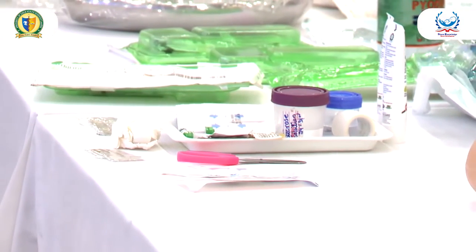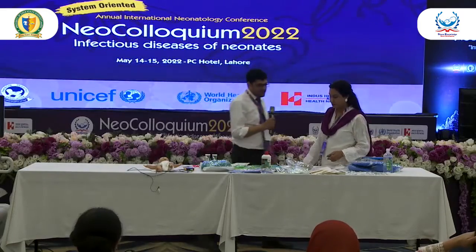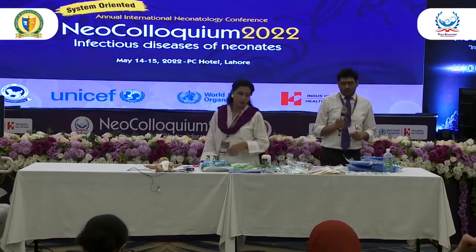Assalamualaikum. We are about to begin the demonstration for PICC line insertion. Whenever we start PICC line insertion, first we are supposed to prepare ourselves, prepare the baby, and prepare our equipment. To prepare ourselves, first we'll wash our hands. Then, after washing our hands, we'll prepare the equipment and the baby.